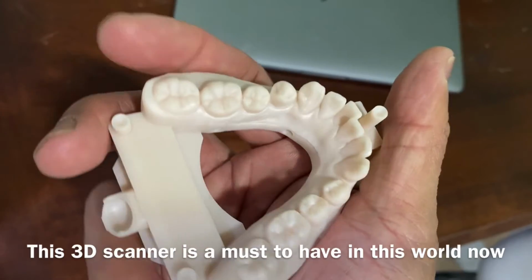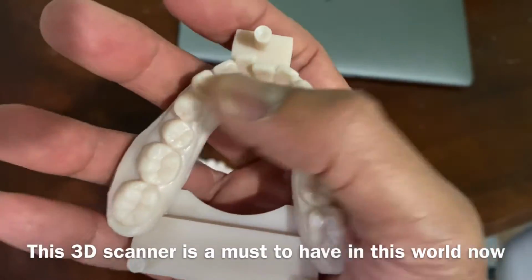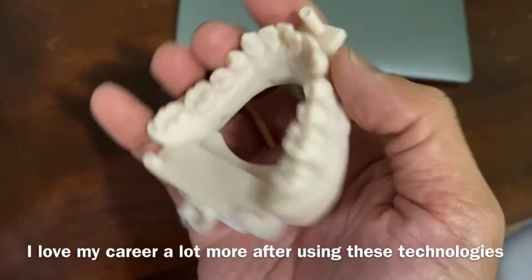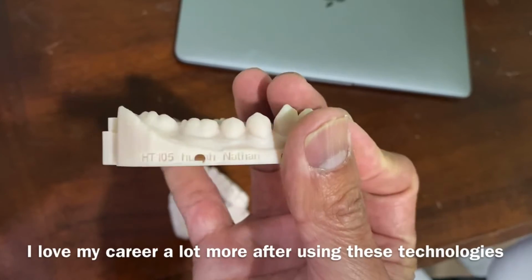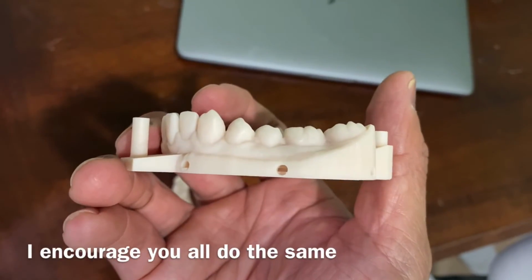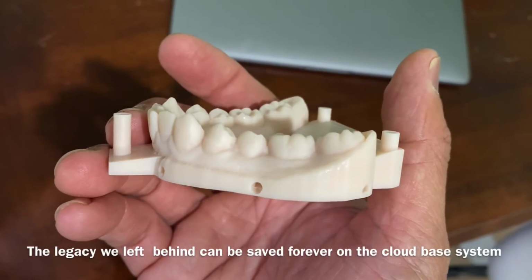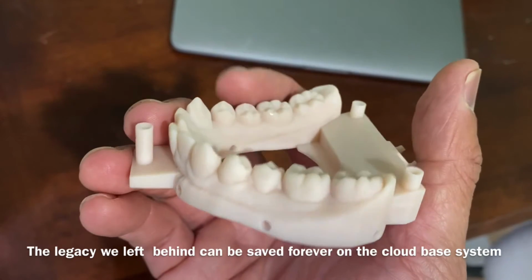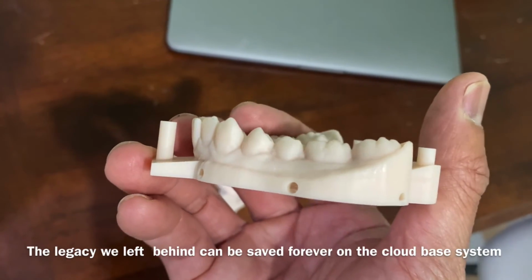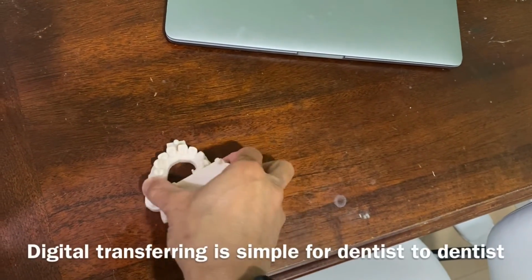It's just so wonderful. And now you can hold it like this and look at the patient's teeth. The anterior is a little crowded, and the occlusal plane has a very deep curve of Spee. This is something that we as orthodontists look at. We general dentists who do braces look at that and make sure that the goal is to put the occlusion into one occlusal plane on the bottom and the top together and put the teeth together.